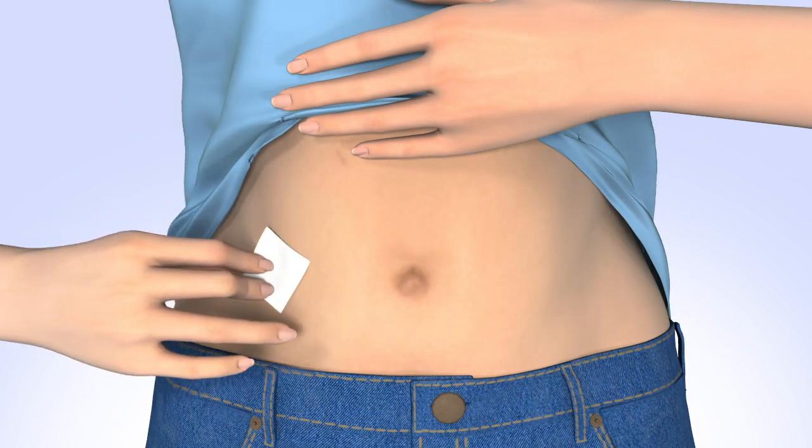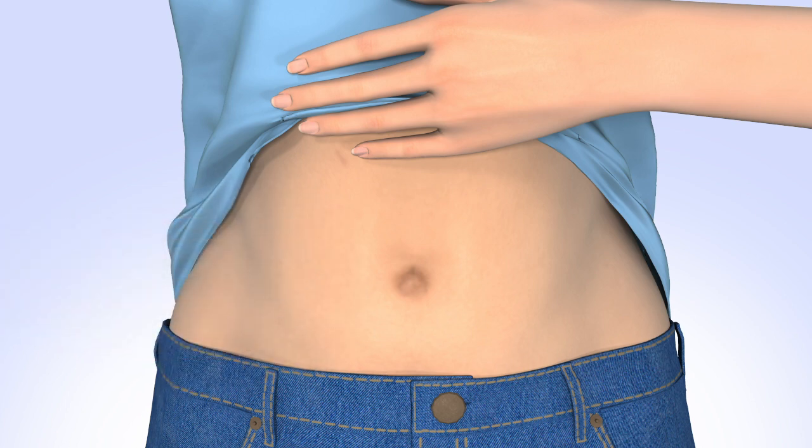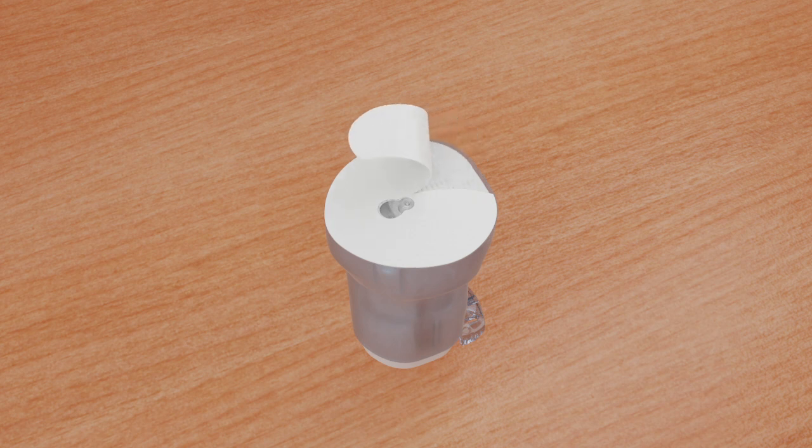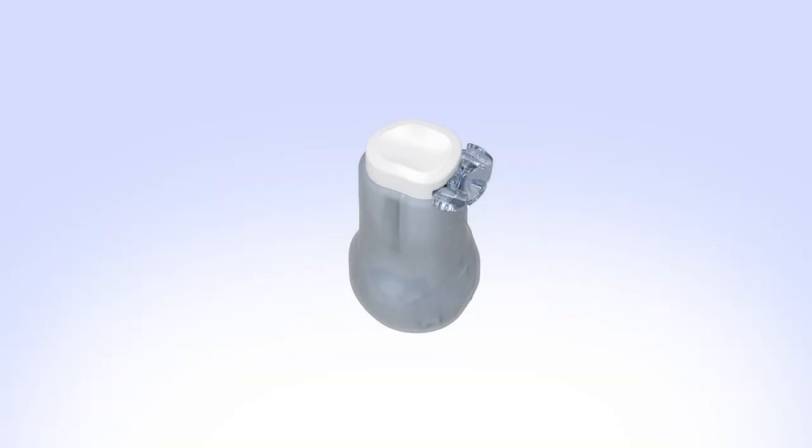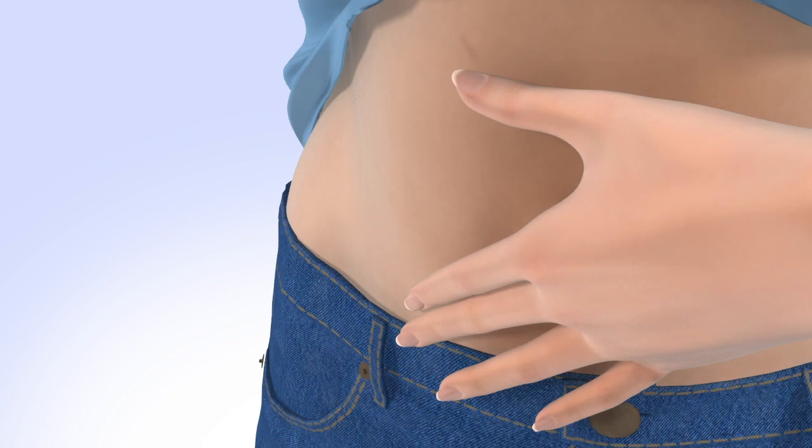Clean your infusion site properly with an alcohol wipe or prep wipe. Allow your site to air dry. Pick up the insertion device and remove the paper backing, being careful not to touch the adhesive. Remove the disconnect cover by gently squeezing the sides and pulling it away from the insertion device. Store the disconnect cover for later use, to protect the cannula housing when disconnected.